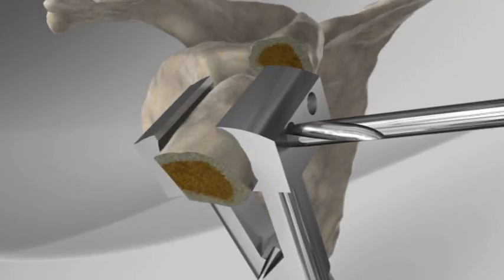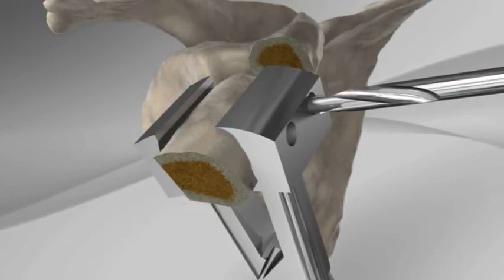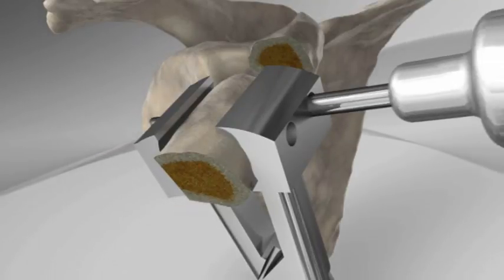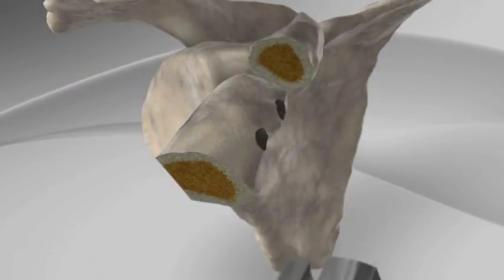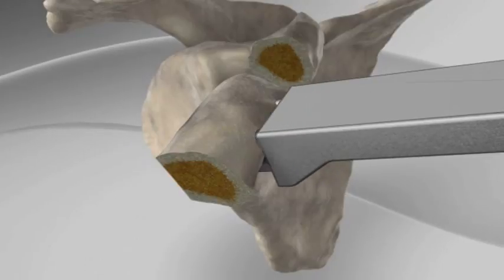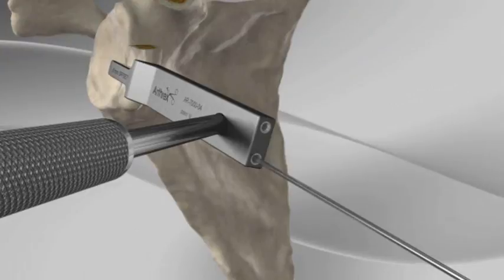A graft holder is used to steady the bone block, and a drill is used to pre-drill holes through the graft. The bone block is placed on a guide, which ensures proper placement on the glenoid, and is pinned in place.